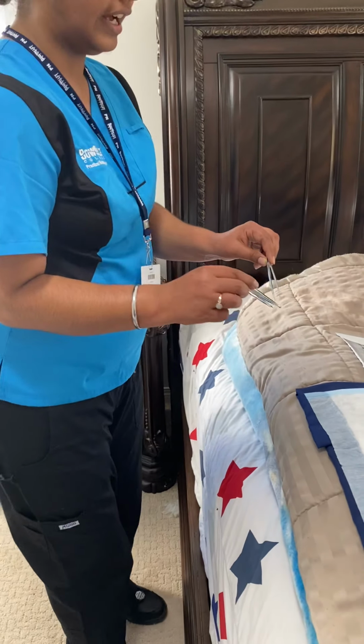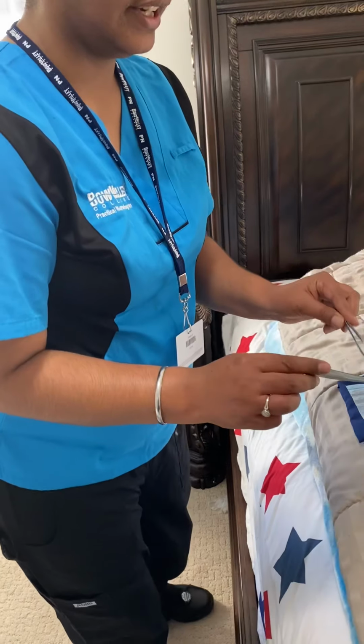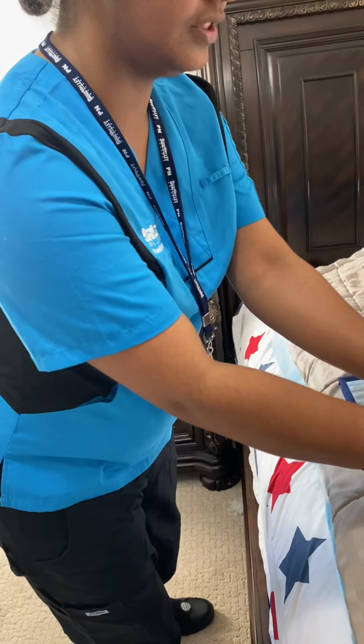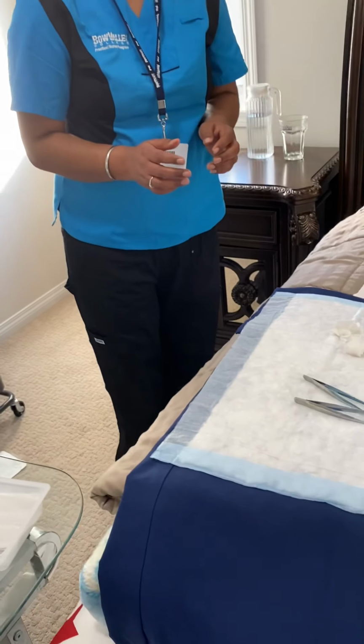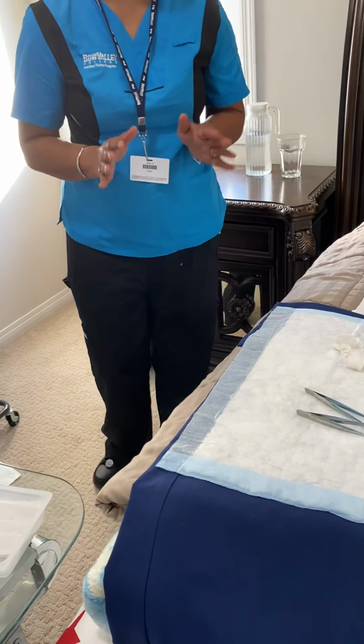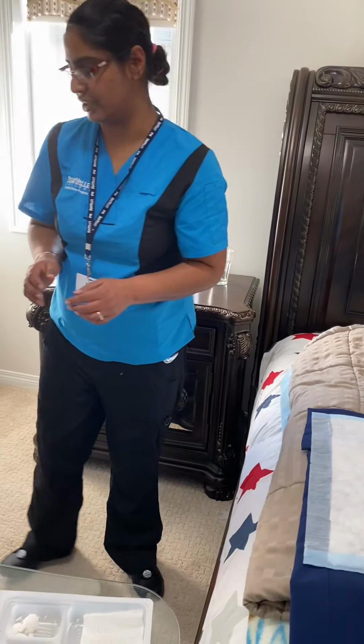So now I don't need any forceps more because they are wet and they are contaminated. I place it on the side. So as you see, my wound is now cleaned perfectly. The edges are closed and there is no redness. And now let it air dry for a second so that I can remove my staples.